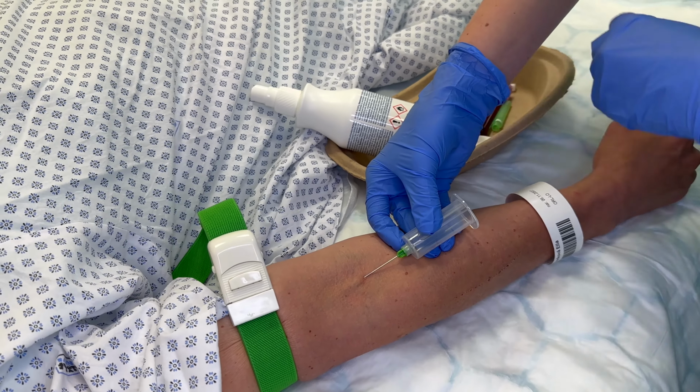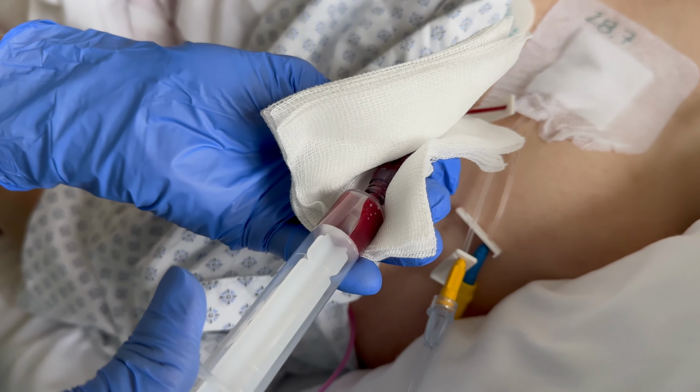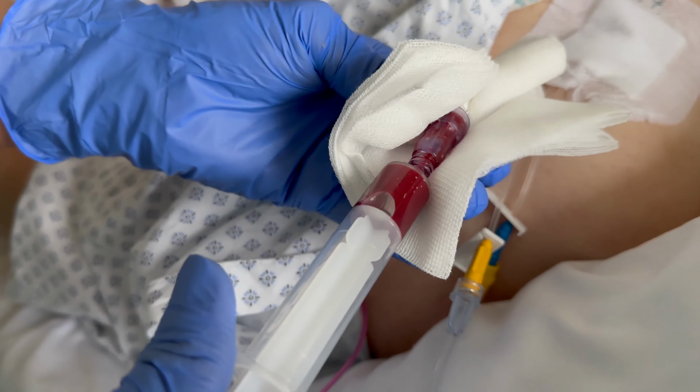A collection system refers to the set of tools used to perform the blood collection. In general, it can be said that the system always consists of a needle for accessing the vein and a collection container into which the blood is drawn. The choice of the type of system used depends on the specific healthcare facility and laboratory equipment.